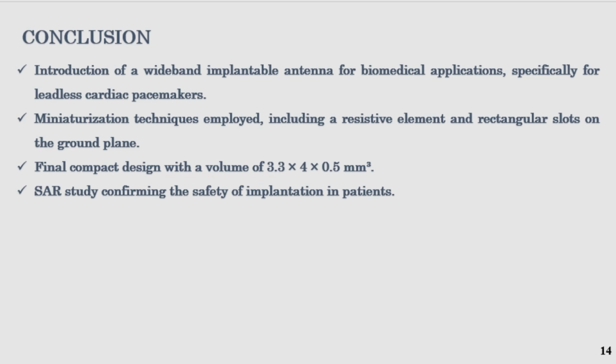The miniaturization techniques employed include a resistive element and rectangular slots in the ground plane. Final compact design: our antenna is ultra miniaturized, and for safety, the SAR study confirms the safety of the implantation in patients.